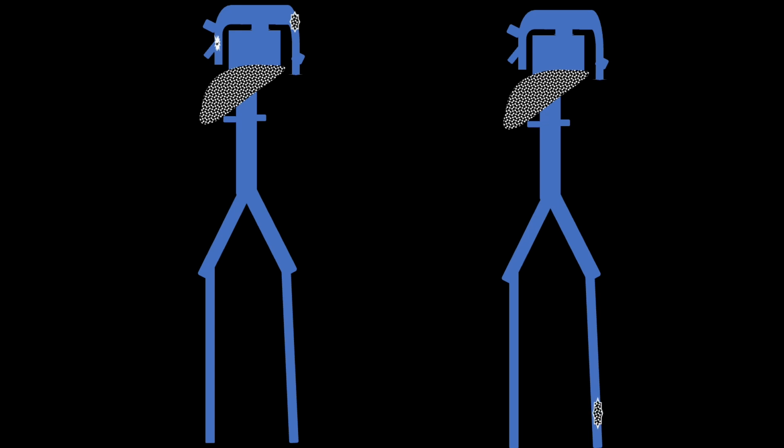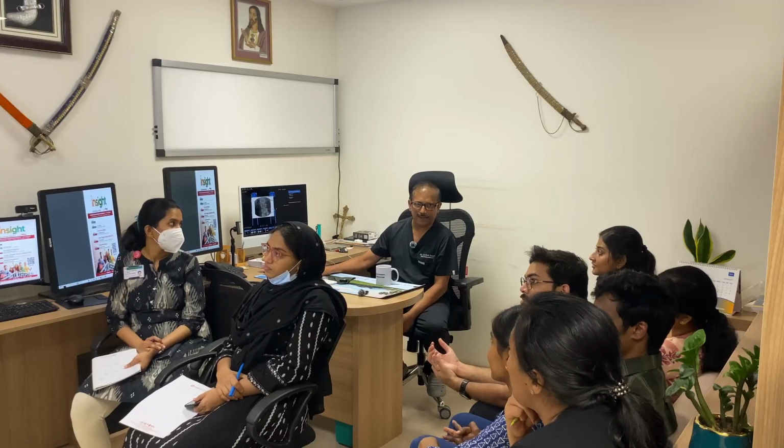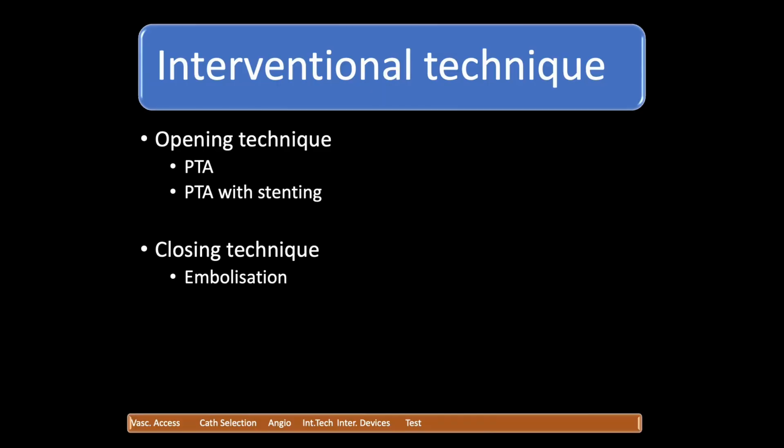So in the venous phase, one of the things that we do is, when you have DVT, what will happen? The thrombus will go into the heart, goes to the pulmonary artery, and pulmonary thromboembolism will take place. In order to prevent that, you put the IVC filter. That should be placed below the renal vein. That is the most important. Can you name one IVC filter? This is one IVC filter. Greenfield. Correct, Greenfield. That is the first one.